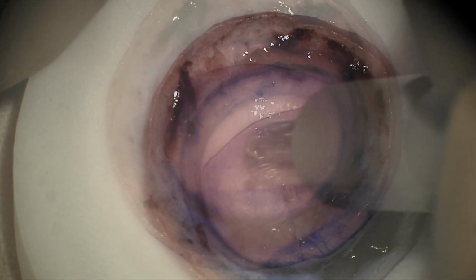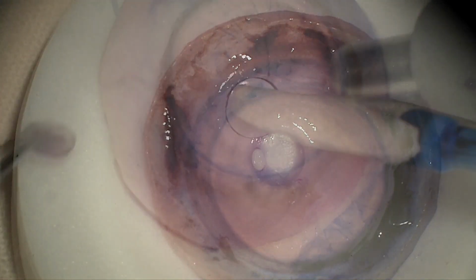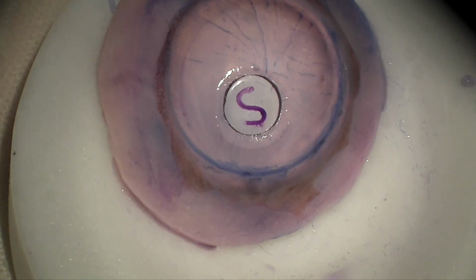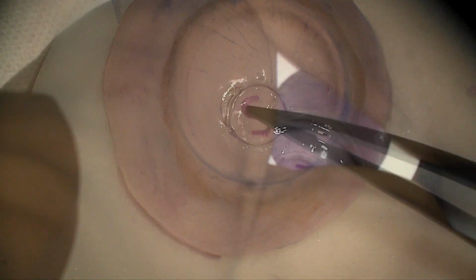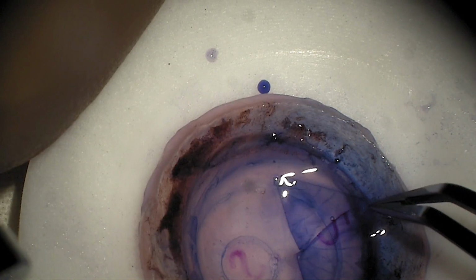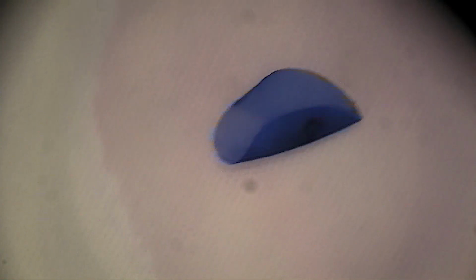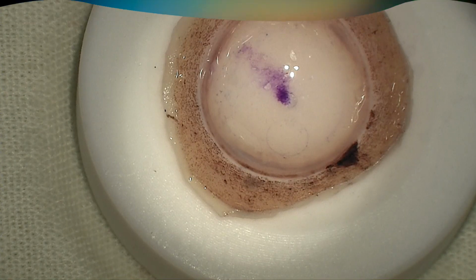Conventionally, most surgeons use a stamped DMEK graft for ease of orientation during unscrolling. To make that, we need an S or an F stamp on the DM side during donor preparation, which is done through a 3 mm stromal window. And naturally, after the window is made, the anterior part of the tissue cannot be used for DALK or other surgeries. In the novel technique using BCL interface, we modify some of these steps.